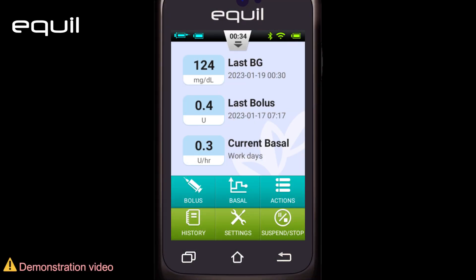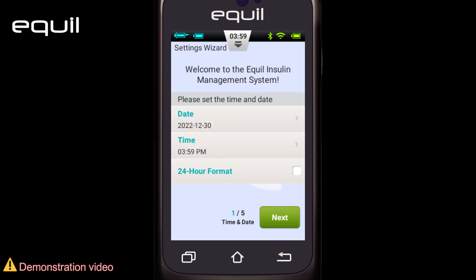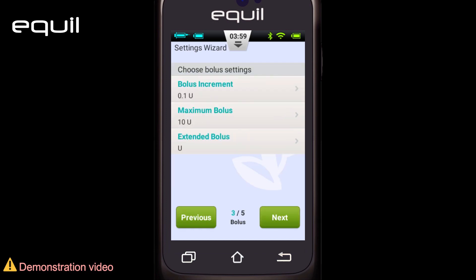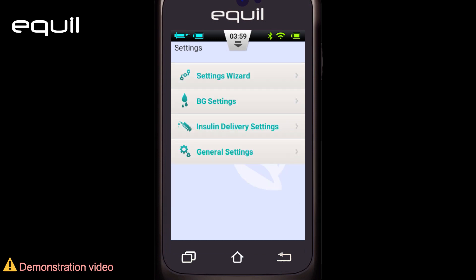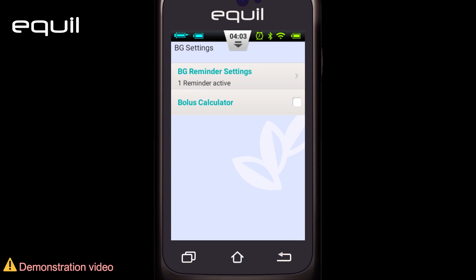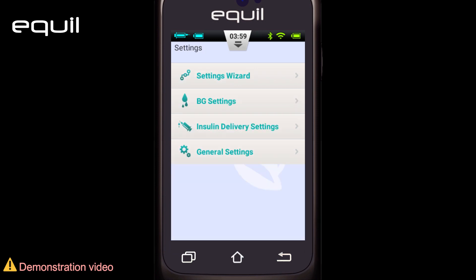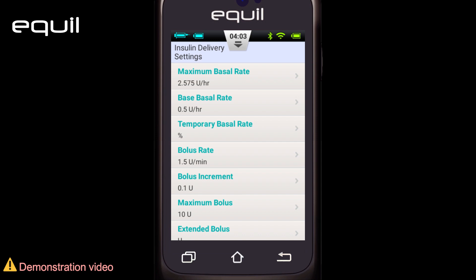One of the buttons in the lower part of the screen is the Settings button. Clicking on it takes us to the settings menu. The Settings Wizard contains all the basic settings needed to operate the pump. The BG, or blood glucose, settings is where we can set reminders for measuring blood glucose or enable the bolus calculator if it wasn't done in the settings wizard. The Insulin Delivery Settings window contains all the settings for administering insulin, whether it is a bolus dose or a basal rate, and some of those settings can be reset here.